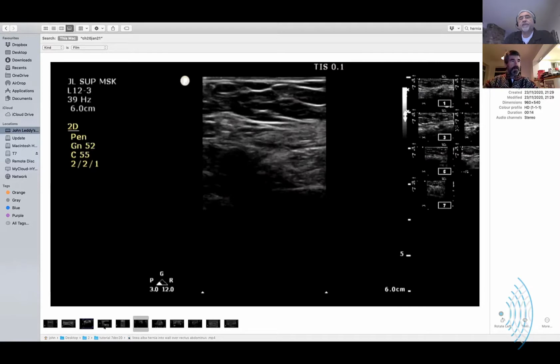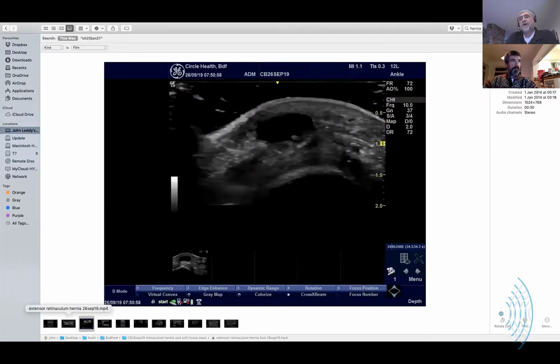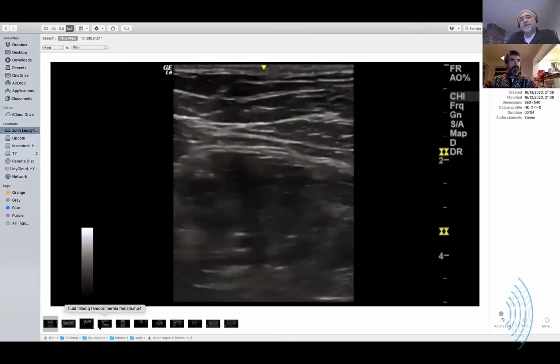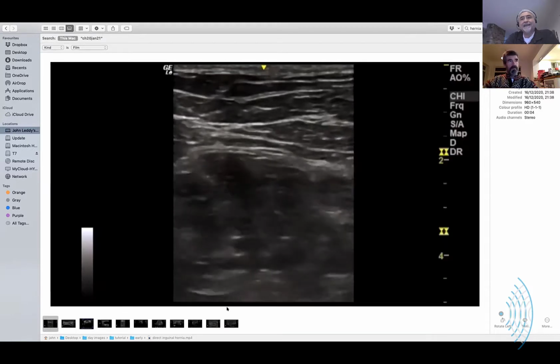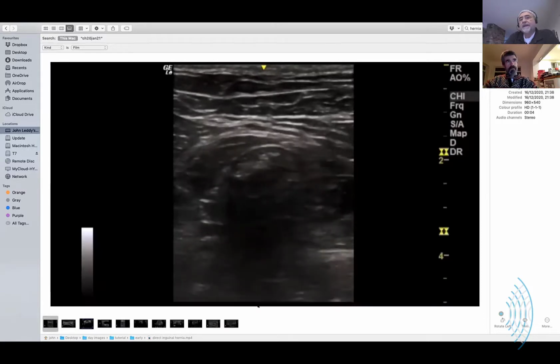So the last thing I want to ask is, how often or how evident do you think a person would be able to identify compromised oblique muscles, meaning a focal internal oblique muscle tear? I guess that's about as difficult to see as a gastroc tear or a quad tear, at least in the mid fibers.